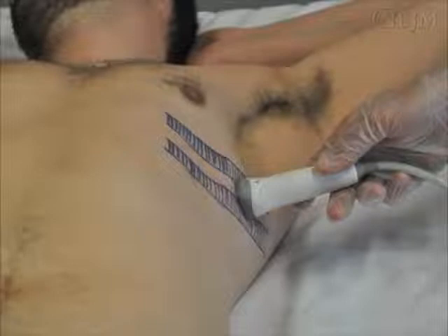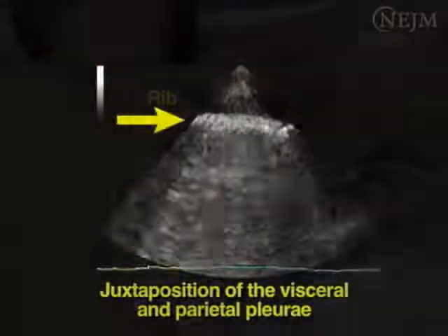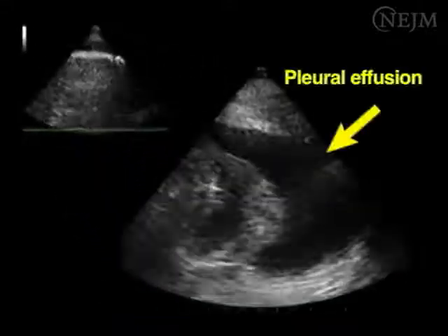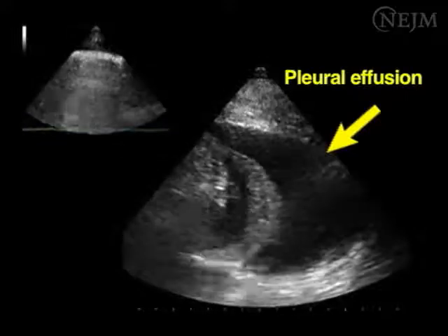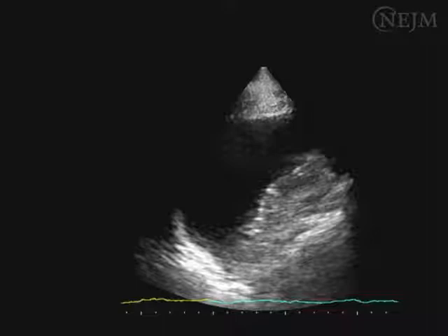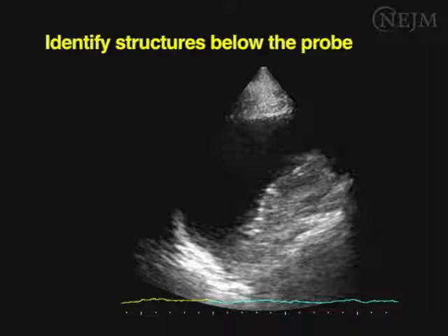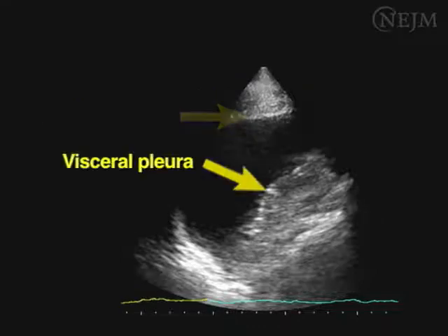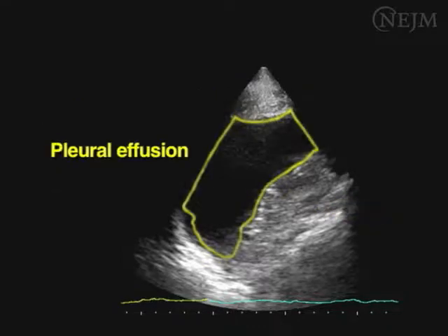Position the ultrasound probe in parallel to the intercostal space. Hold the probe firmly and perpendicular to the chest wall to obtain the best acoustic window. Normally, the visceral and parietal pleura are juxtaposed and moving with the respiratory cycle. The pleural effusion is shown as an anechoic space between the two pleura. You should be able to identify the structures below the probe — from surface to depth: the skin, the muscles, the parietal pleura, the visceral pleura, and the lung parenchyma. The pleural effusion appears as a space between the two pleurae.